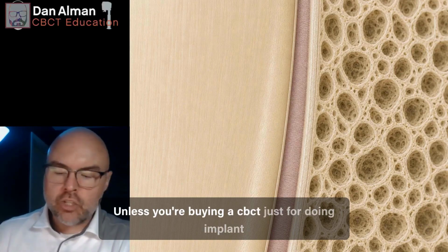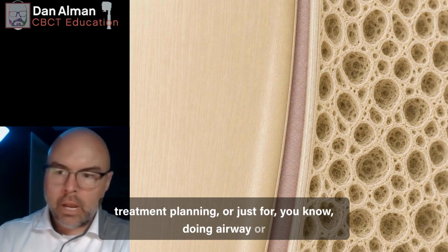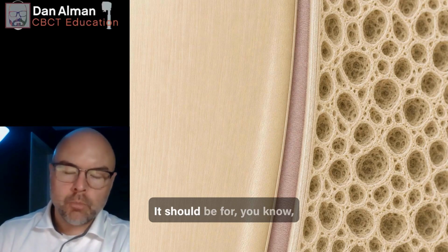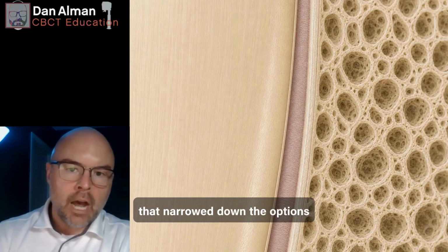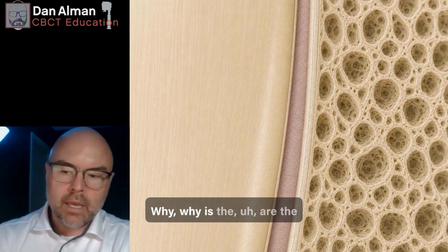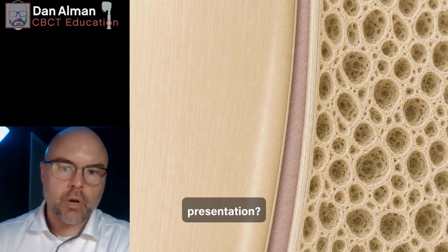Unless you're buying a CBCT just for doing implant treatment planning or just for doing airway or something like that, that's one thing. But if you are a restorative practice, CBCT is not for treatment planning. That shouldn't be the reason why you guys are buying CBCT. It should be for eliminating the variables that narrow down the options in terms of what's going on with your patients, what the situation is, why are they in for pain, why are the 2D X-rays and the evaluation not lining up with the patient presentation.